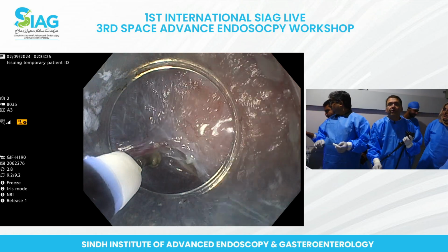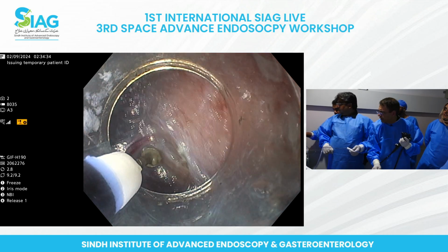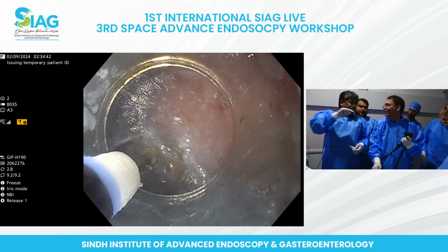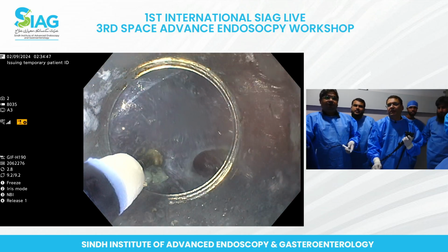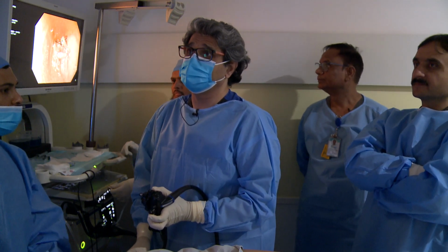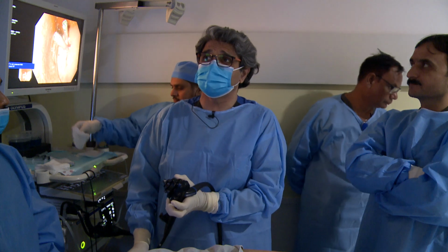Farooq, you've taken the lesion out? Hello? That was the duodenal lesion, and it is gone. I always clip duodenal lesions, whether they bleed or they do nothing. Always, as a standard. Sorry, man, I didn't realize that we were going live. No, you were not actually. We missed the removal. It was really just an EMR. We didn't even go for it. The lesion was too small. It wasn't worth it.